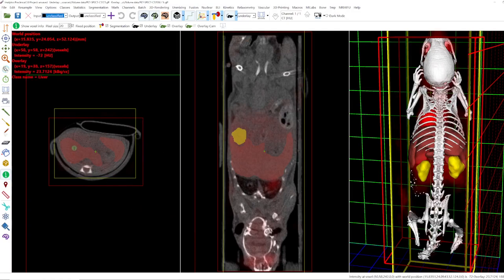When I hover over a voxel here inside the liver, you can see the coordinates for the underlay and the overlay, as well as the intensity for the overlay and also the intensity for the underlay. For example, the underlay is minus 72 Hounsfield units; for the overlay we have 26.059 kBq per cc. You can also see the class name — so this voxel belongs to the liver.